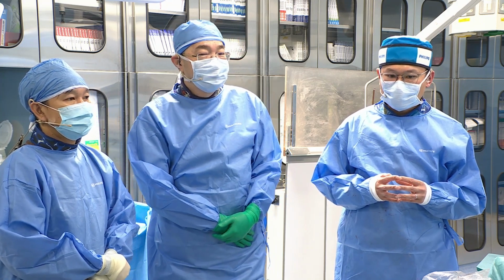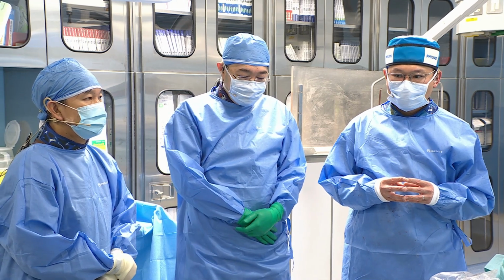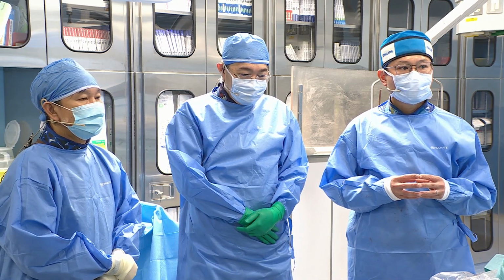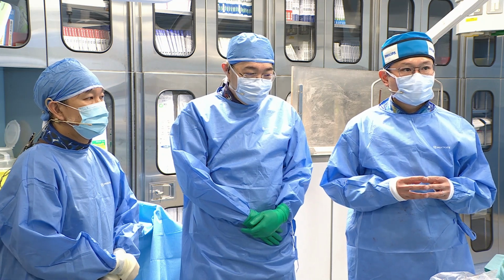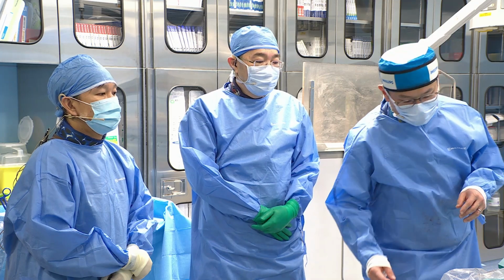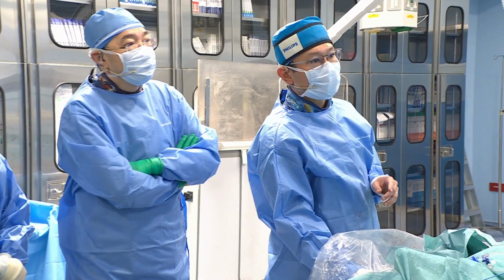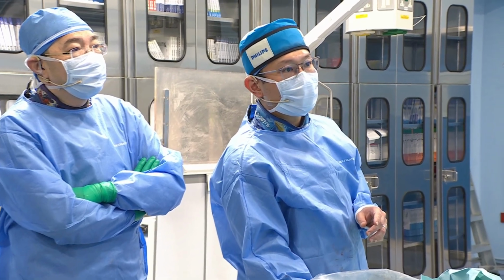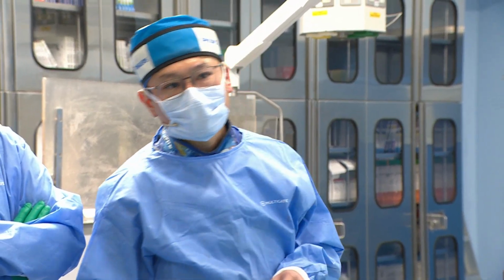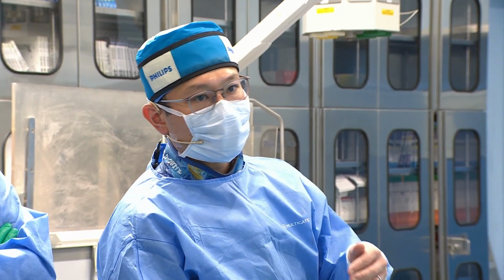What about the criteria for optimal stent expansion for left main? What do you think in this case? You got about 8 something, right? In this case, it's a bit tricky to apply those criteria. It's just a single stent rather than a bifurcation stenting.